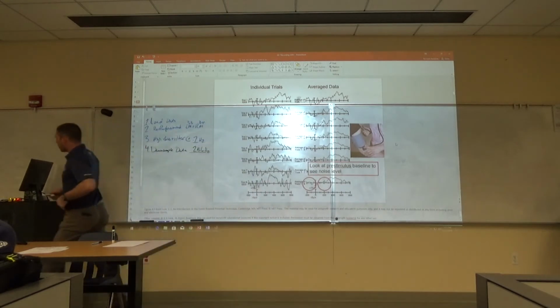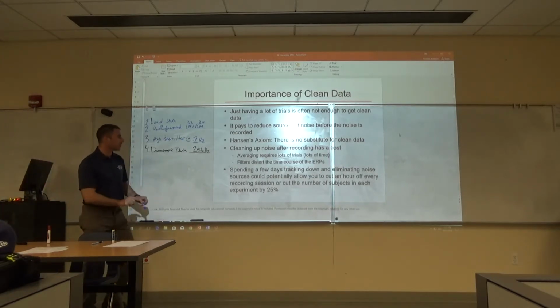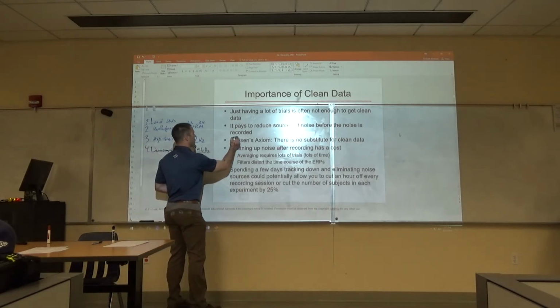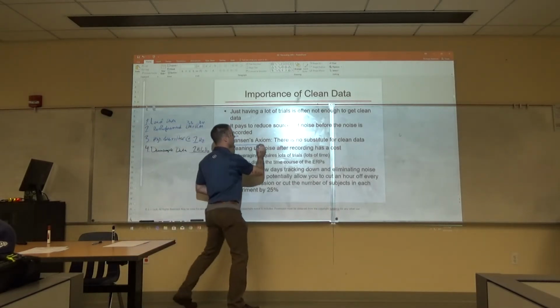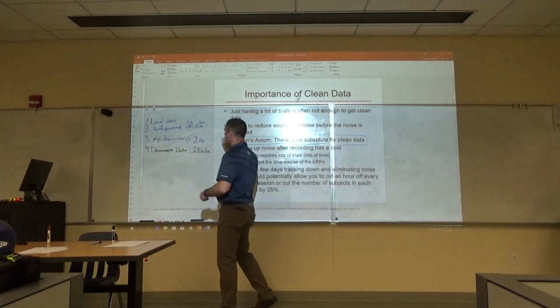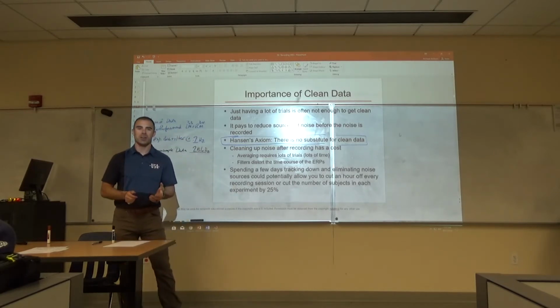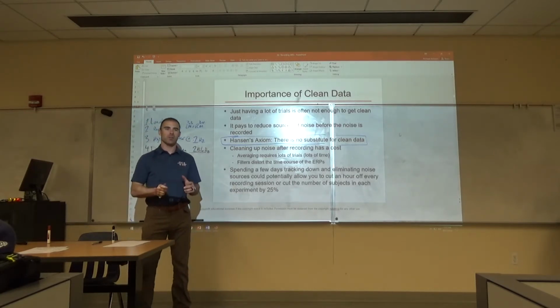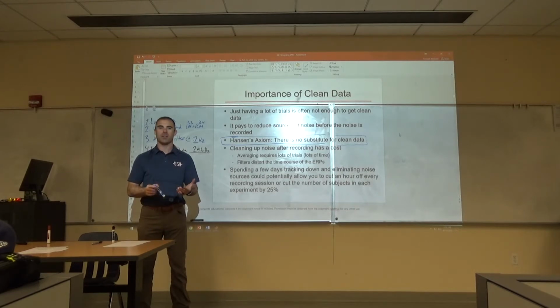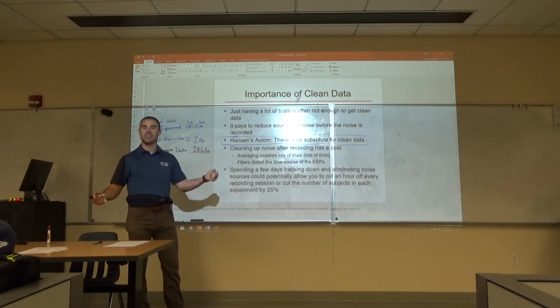Okay, so one thing to keep in mind as we're going through this process is that I want to emphasize one part of this slide, which is that there is no substitute for clean data. Okay? If we were at a workshop, or if I was doing a version of our own ERP boot camp down here, I'd have everyone chant it together and say, there's no substitute for clean data.